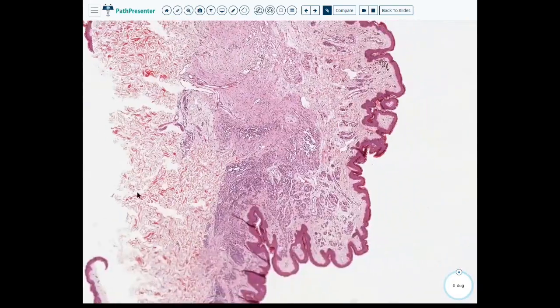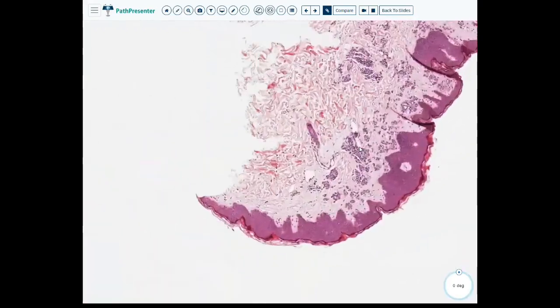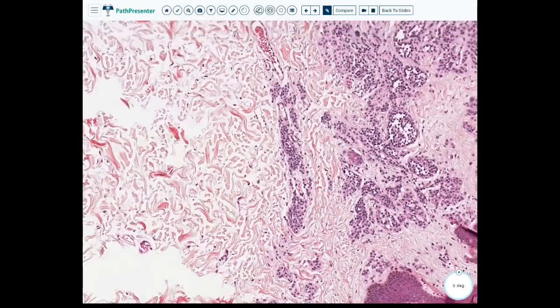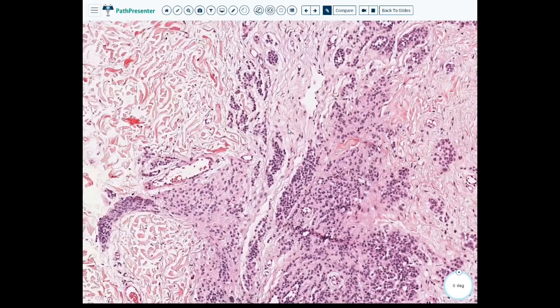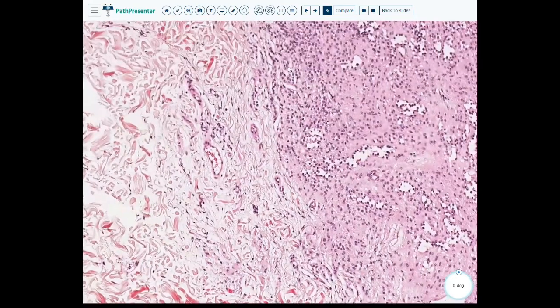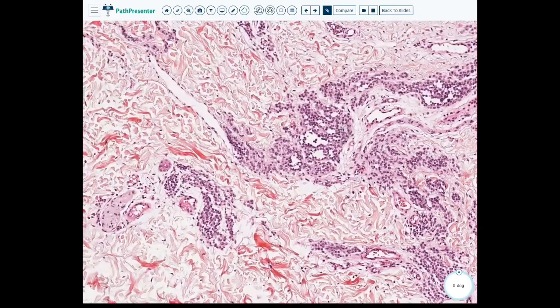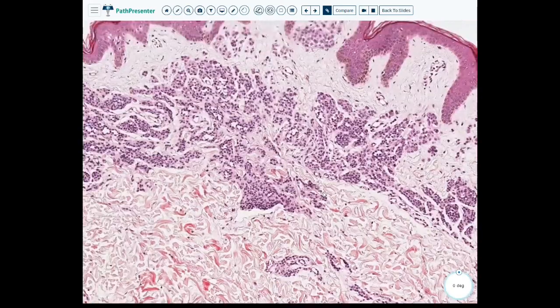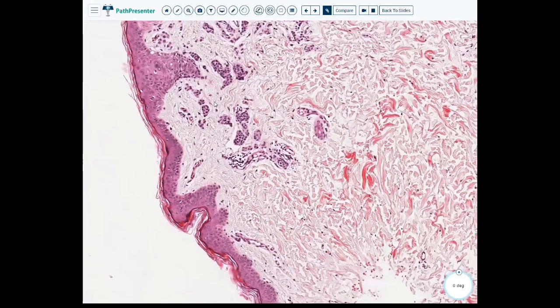And maybe find out in the patient's history that, you know, maybe this is a pediatric derm case. Like maybe they're 5 years old. Well, that would be unusual for them to already have acquired nevi. Or the patient could just tell you that they refer to this lesion as their birthmark, but they would like it removed. So again, another variation of the congenital nevus.